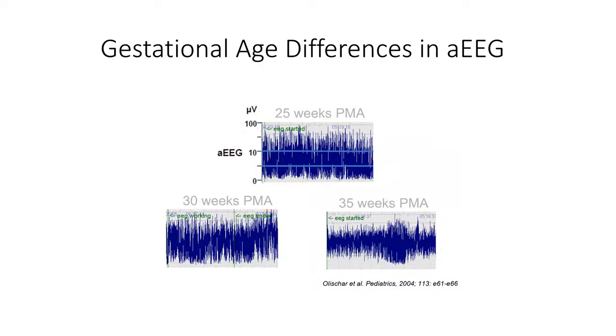And just because they're preterm, it's not just okay to be discontinuous because you're preterm. There comes a point where the pattern itself is dysmature: we don't have enough cycling, we don't have enough continuous activity, the lower margin is not reaching up towards that 5, and that is not normal. So it is still considered ill, even though it is not a term baby brain. Just make sure you're thinking about that, as we have expectations that the aEEG will improve with time.